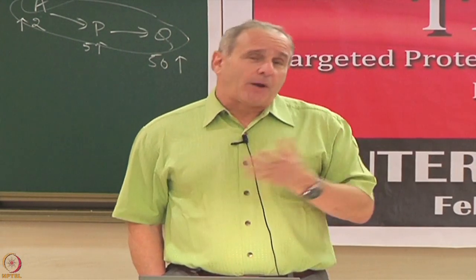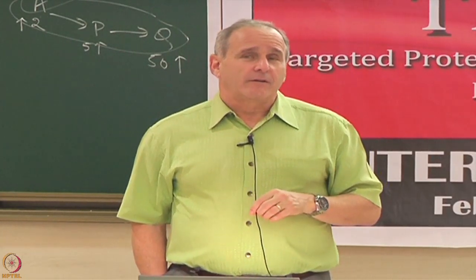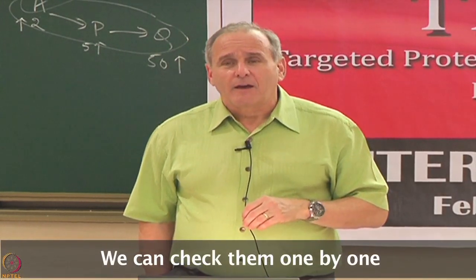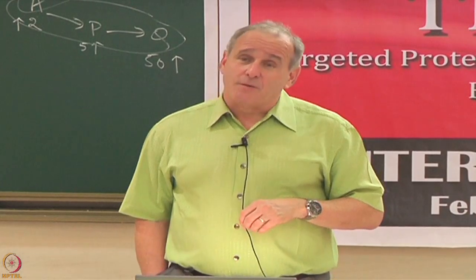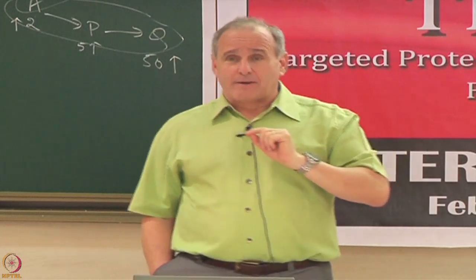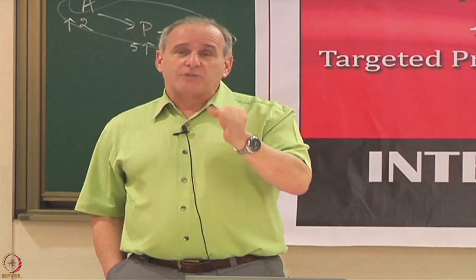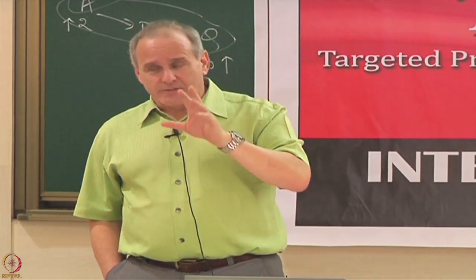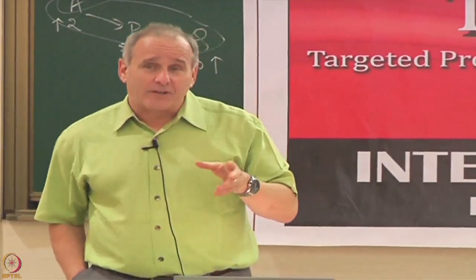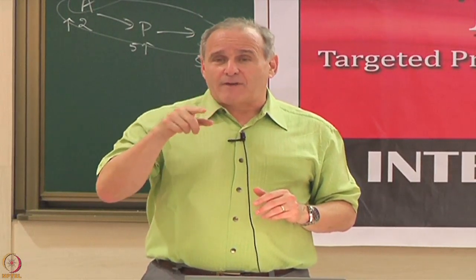You could look at that, the problem is that for most proteins we don't have the functionality. What other ideas we got? You could certainly test them one by one in the mix. That's how we went about it, right? So what we did is we said, well, let's make mixtures of proteins for which we have antibodies. So in this case we're testing only proteins that we can come back and test. And then we're going to ask the question, if I mix a bunch of proteins together, if I test it, will I find the protein?